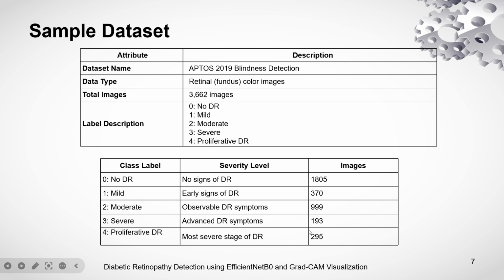So for this, I'm using the class weight method, class weight based balancing. What I'm going to do is, if I give an image from this third severe class and my model predicts it as some other class, then I will impose more penalty for that. The loss for this will be high compared to that. So my model will understand that if an image comes from this class, it has to predict right, else there will be more loss. Since my model's aim is to reduce loss, it will predict right. This is class weight based balancing.